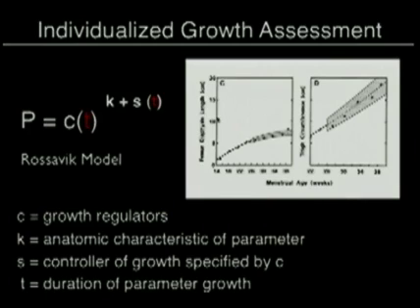And essentially, what we have here on the right is an example of femur length or thigh circumference, and we have these dots here. We have actual data from the fetus before 26 weeks that helps establish C, and then from that information, we use the function to calculate the expected statistical range of normal for that given fetus, given the growth velocity during the second trimester, using each fetus as its own control. So in this case, we don't have to be wondering about trying to scan a patient from India or Southeast Asia or someone and plotting against an inappropriate population-based curve.